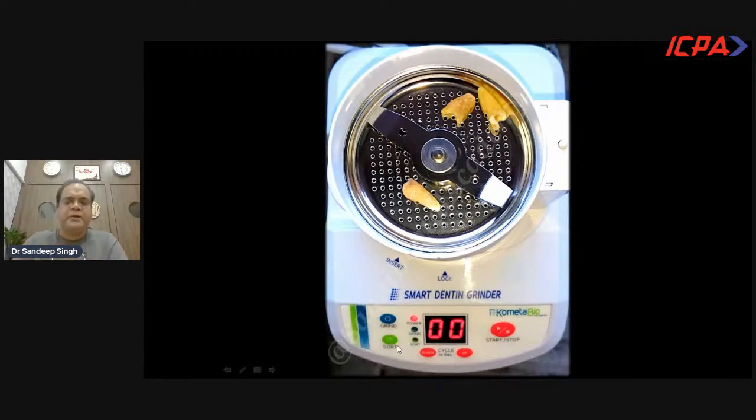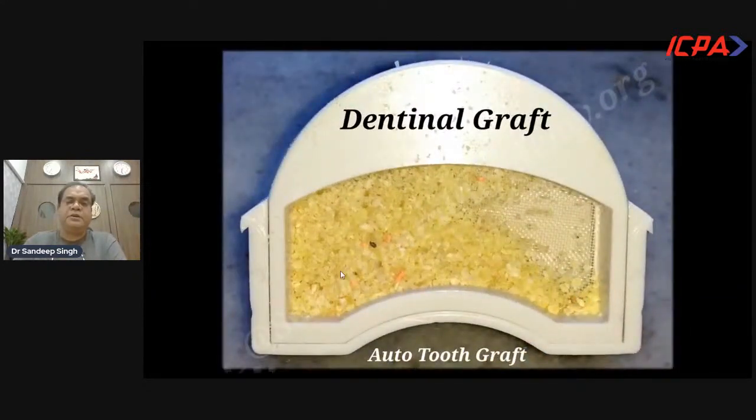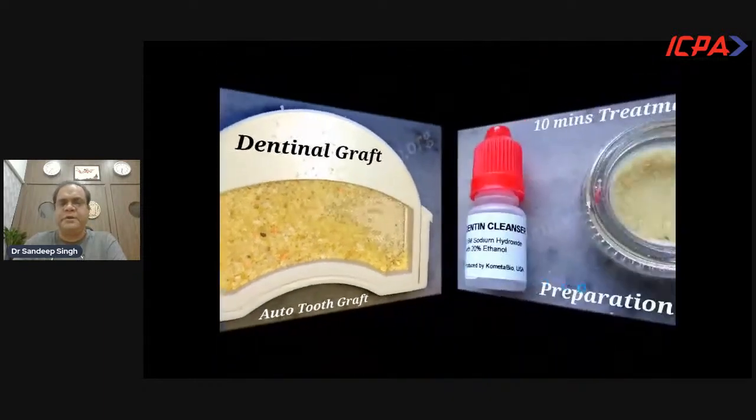And you can program it for 3 seconds grinding, and then 10 seconds sorting, and then you can start and stop the motor. So there is no overdoing and no overheating. It works automatically. And this is what you get. But if you see, this was my first time, you can see small particles of gutta percha here. I'll not advise that. But still, I took it out and I used this material.